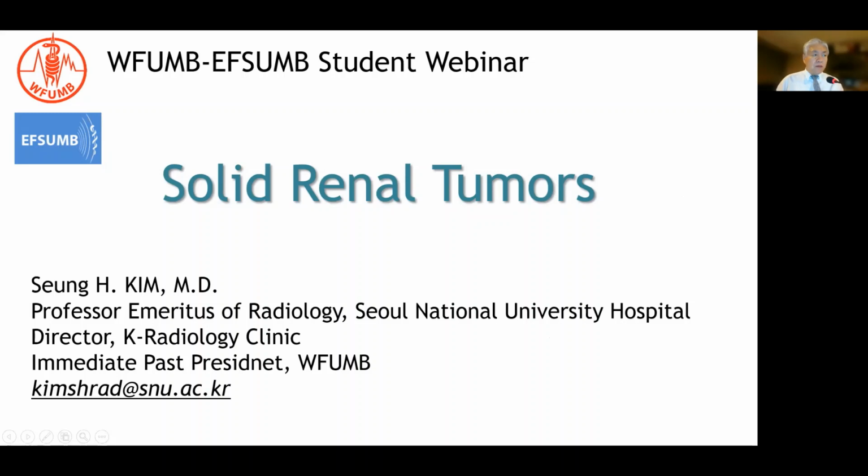Hi everyone, it is my pleasure to join this WFUMB-EFSUMB Student Webinar, and I will talk about ultrasound characterization of solid renal tumors. I'm Seung H. Kim, Professor Emeritus of Radiology, Seoul National University Hospital, and the Director of K-Radiology Clinic. And I'm the immediate past president of WFUMB.